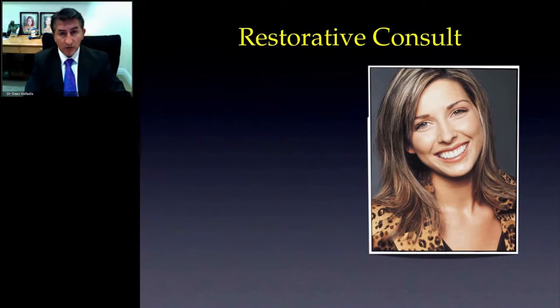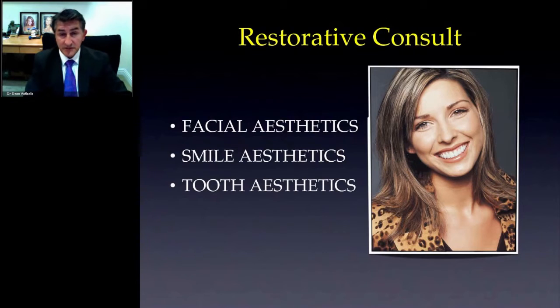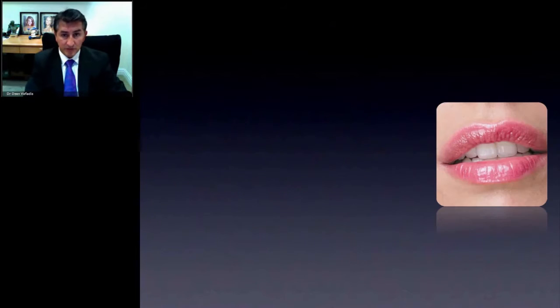Let me just kind of hold in on the restorative consult and how we approach the patient from start to finish, so at least you get a handle on how we do our consultations. We look at facial aesthetics, smile aesthetics, and tooth aesthetics. We take a lot of photography in the beginning, and that helps us analyze the patient and be able to really control the conversation with them and actually show them different things on the screen.